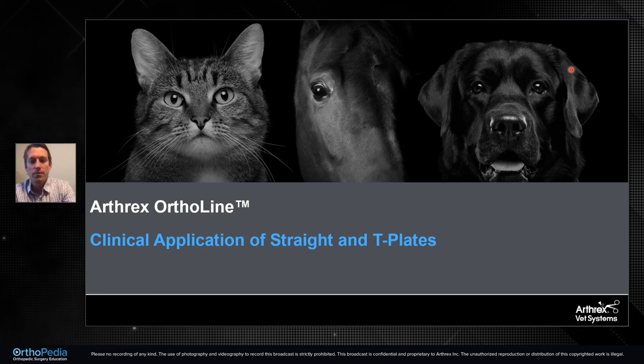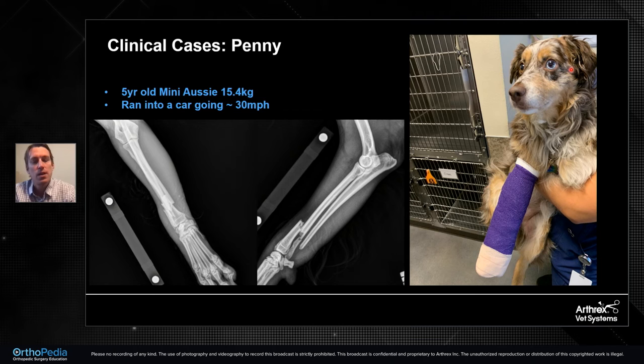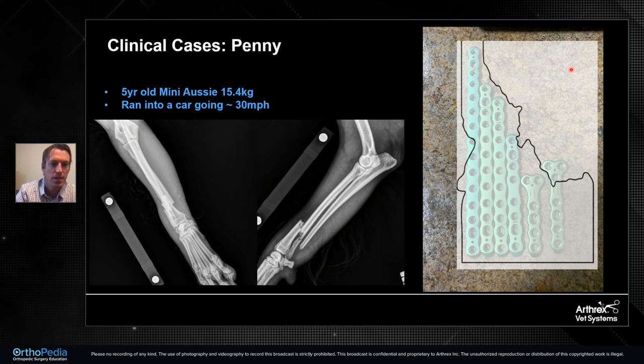So finally, I just wanted to close with a few clinical applications of these plates being applied to true clinical cases. And so this was our first case here. This is a 5-year-old mini Aussie with a distal radius ulna fracture who ran into a car going about 30 miles an hour. So pretty standard distal radius ulna fracture.